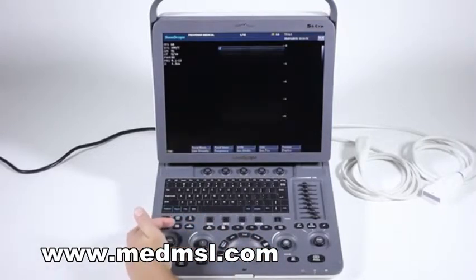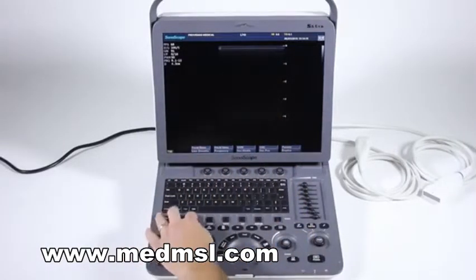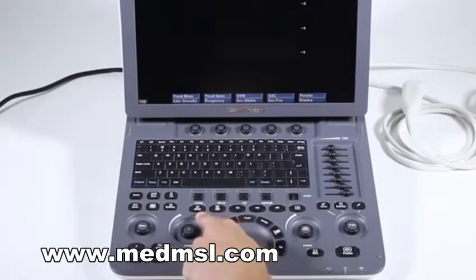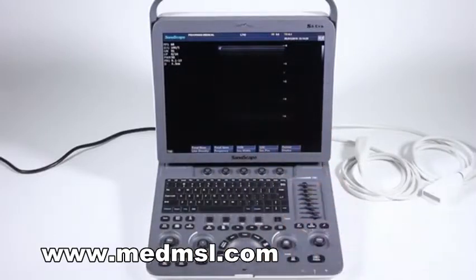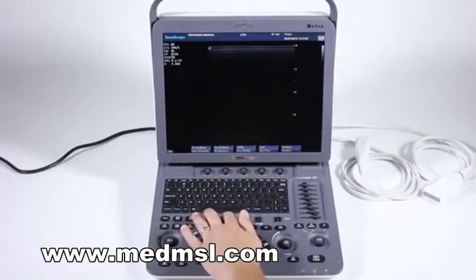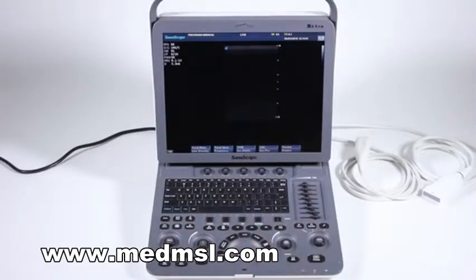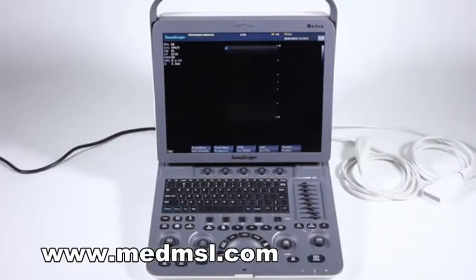There's dual imaging mode, quad imaging mode, end exam, swap left or right, and swap up and down. 3D is available if you have that option enabled. Focus allows you to change your focal zones — the little red arrow refers to the focal zones. You can change your depth going up and down. PRF is for pulse repetition frequency, baseline is for your Doppler baseline, and steer is also for Doppler modes.